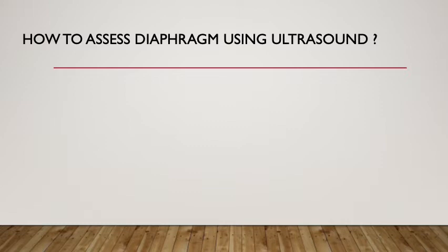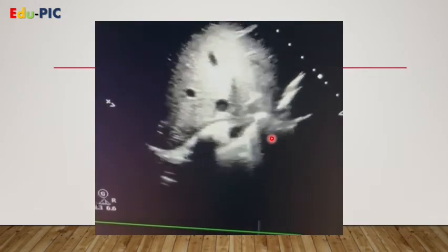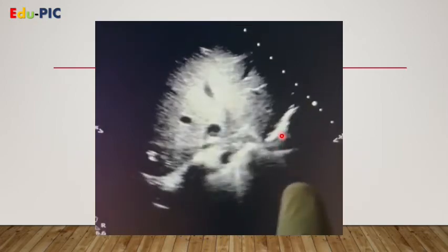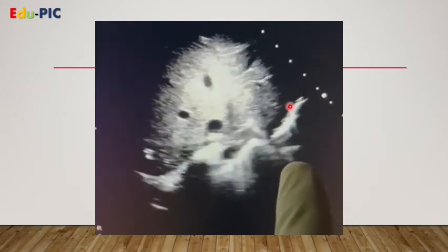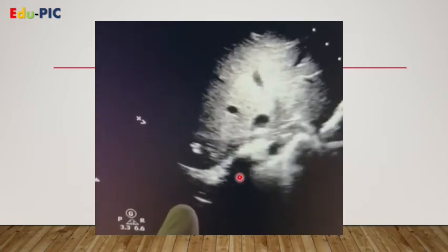How to assess diaphragm using ultrasound? We can assess diaphragm through two approaches. The first one is a subcostal view, putting the probe in the subxiphoid area and trying to get the two diaphragms clear, as we can see here in this image. And here is a video showing that the left hemidiaphragm or the left copula is moving downward freely with inspiration, while the right one is fixed. It's not moving at all.